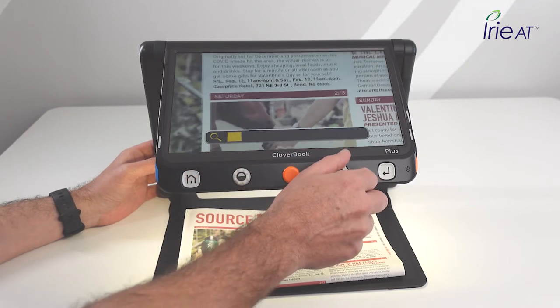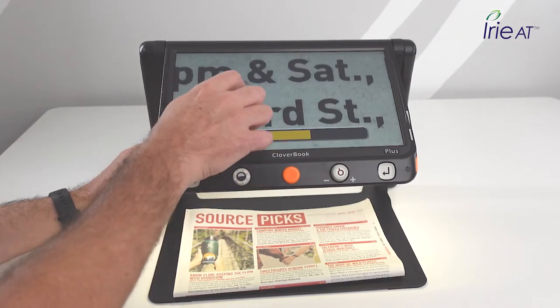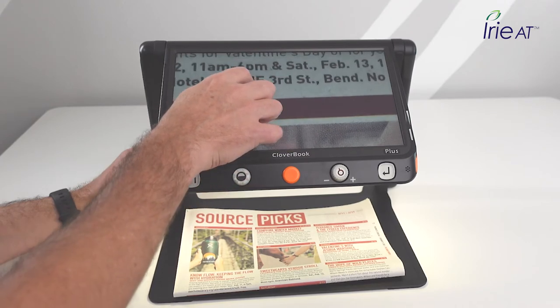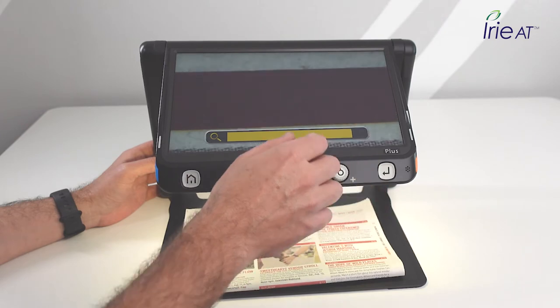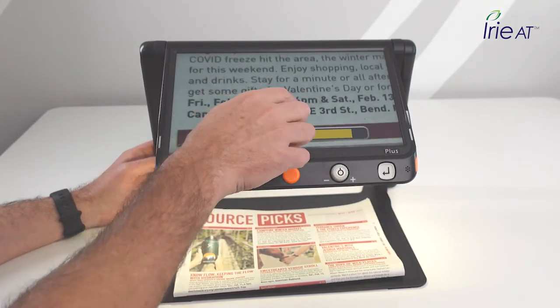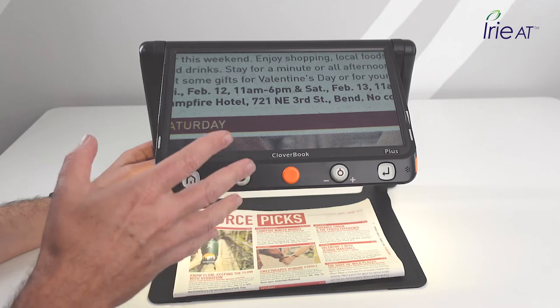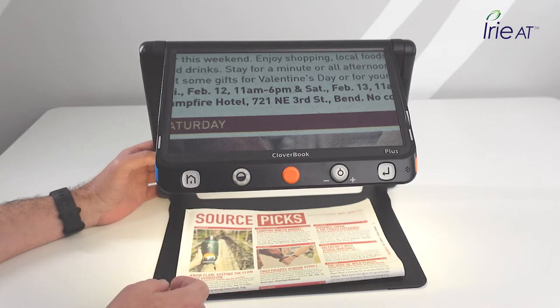To magnify, you can turn the zoom wheel or use the touch screen — it's very adaptable to however you want to use it. Sometimes you want your hands out of the way and use the wheel; sometimes you want to pinch, zoom, and move at the same time using the touch screen. Right off the bat, this gives you a nice clear image, which is our expectation of a professional magnifier.